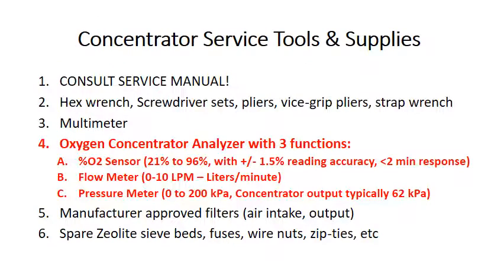Okay, concentrator service tools and supplies. Well, of course, consult the service manual, the very first thing you do. But in general, you want hex wrenches, screwdriver sets, pliers, vice grip pliers, and possibly a strap wrench. You'll definitely want a multimeter, and certainly you'll want an oxygen concentrator analyzer with 3 functions.